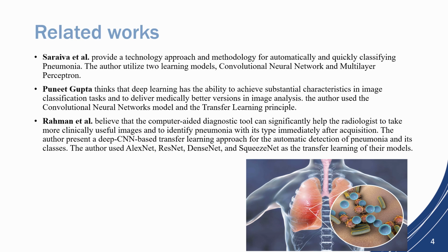The last one, Rahman et al. believe that a computer-aided diagnostic tool can significantly help the radiologist to take more clinically useful images and to identify pneumonia with its type immediately after acquisition. The author presents a deep CNN-based transfer learning approach for the automatic detection of pneumonia and its classes. The author used AlexNet, ResNet, DenseNet, and SqueezeNet as the transfer learning of their models.